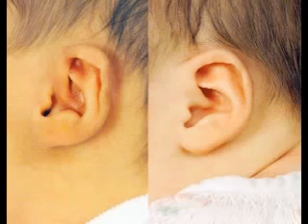The retractor essentially grasps and encircles the helical rim, and its conformer shapes the scapha fossa, while the outer arc of the retractor shapes the helical rim into its natural fold and arc.